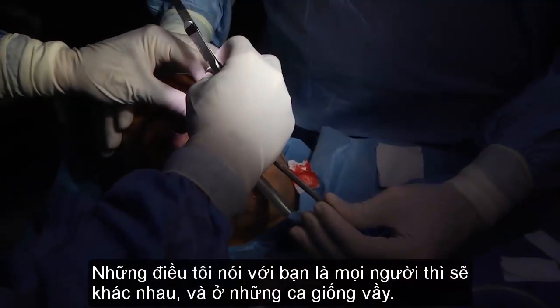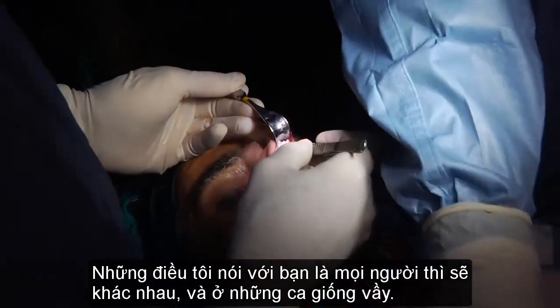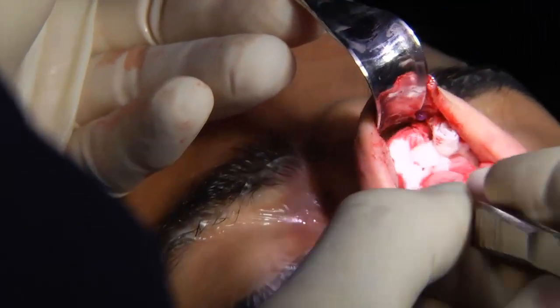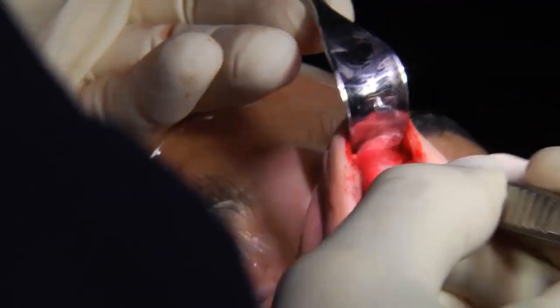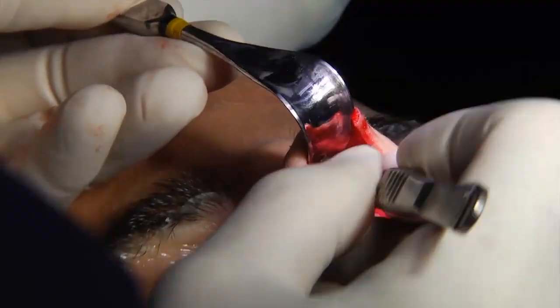So what I was telling you is that people are different, and in a case like this I can see, hold the head still, that it will be easy to peel these structures just away.